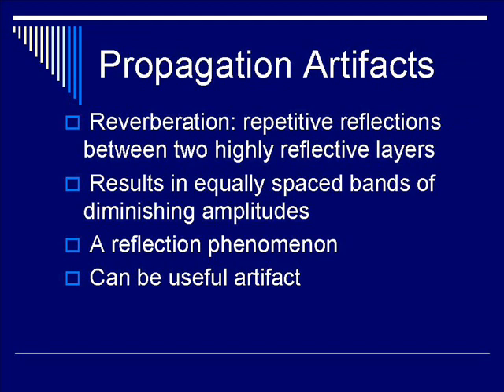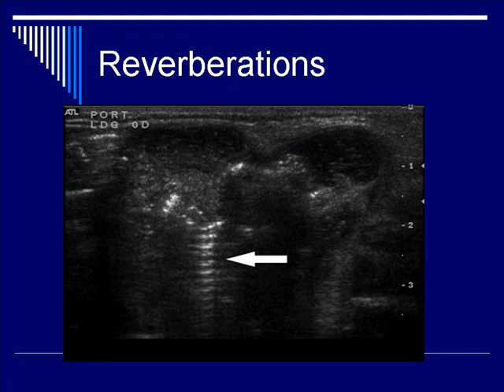In this next ultrasound still image, we show that within this tumor of an unspecified location that is reflective of the ultrasound waves, you have this classic reverberation picture of the first echo — the brightest hyperechoic band — followed by multiple lines of equally spaced bands of diminishing amplitude, as pointed out by the arrows.